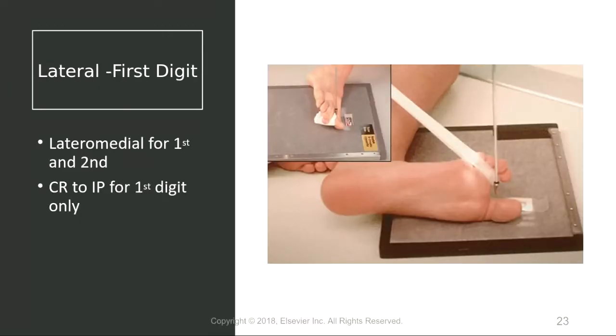And then we do lateral of the toes. Now, let me tell you, fingers are a lot easier to position the patient and have the patient hold than toes. Some people have a lot of dexterity with their toes. They can separate them out. They can hold them in position. Some people not so much.